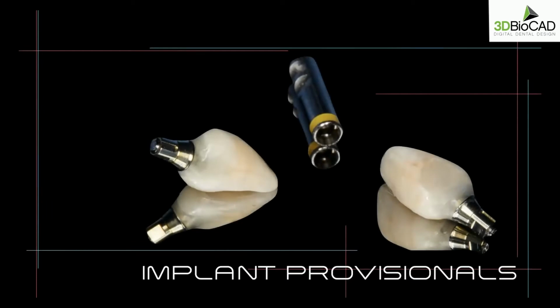We polish it really well, and we clean the temporary crown really well too. Now it's really, really important that it's really well polished, and also that there's no debris and polishing paste on the restoration. So what I like to do is use a wet gauze and just wipe the temporary really, really well, especially the subgingival part of the temporary restoration. And then I use a steamer to steam and clean up all the debris and that kind of stuff off of the temporary restorations.